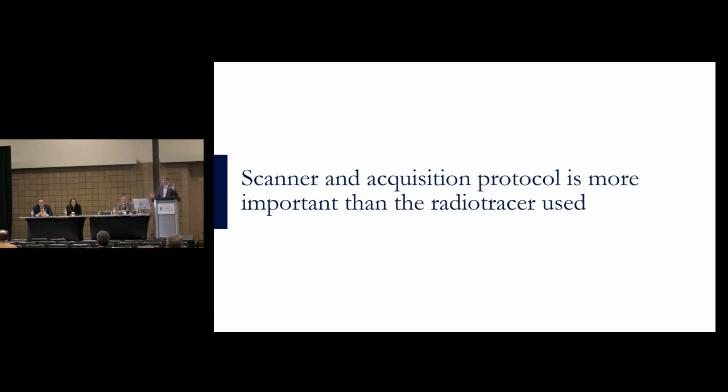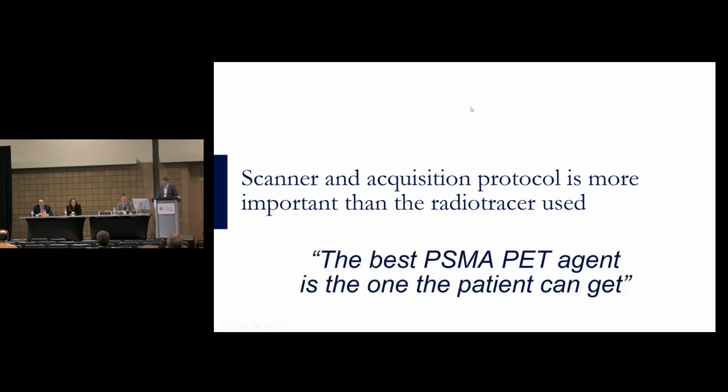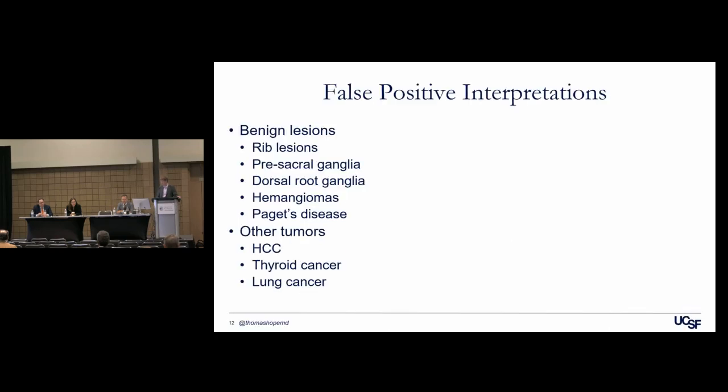So this idea that we have to worry about this tracer versus that tracer, I'd like to nip that in the bud. And so in my mind, the best PSMA PET agent is the one the patient can get. Okay? So we want to use this. It's improving the staging of these patients. Don't worry about the differences between these radiopharmaceuticals.